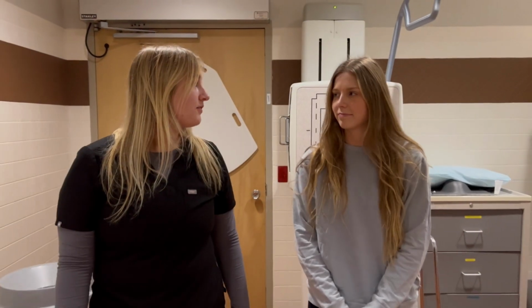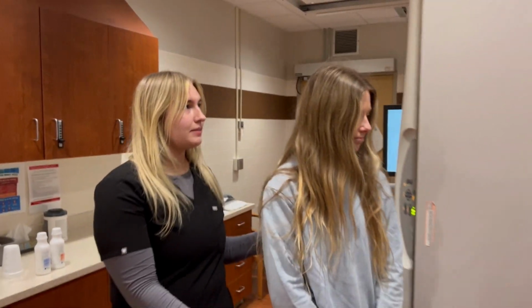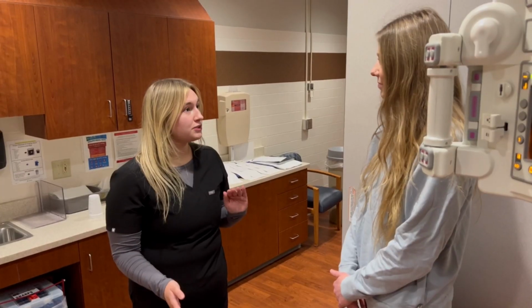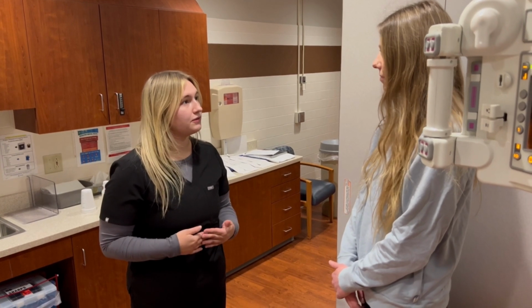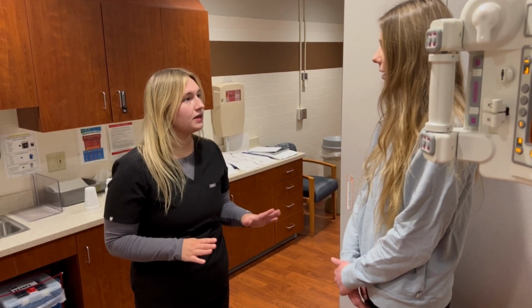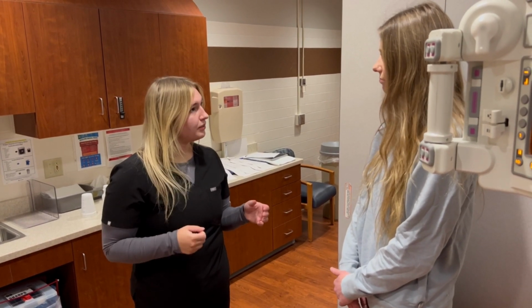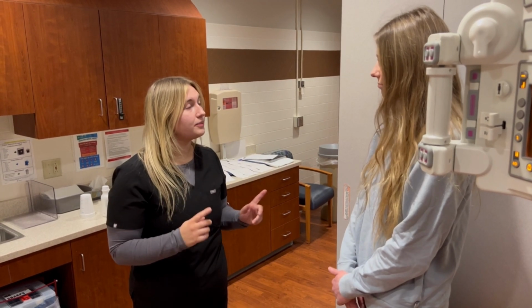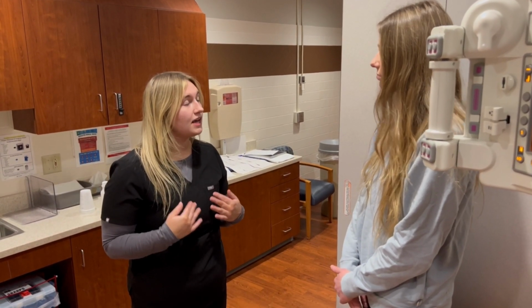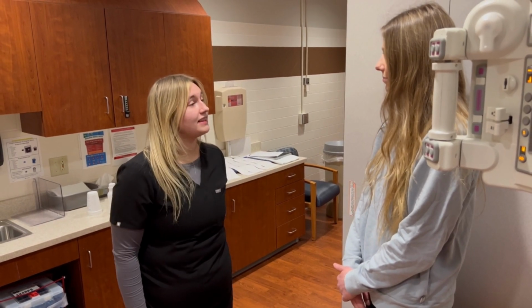Have you ever had an esophagram before, Miss Jackson? I have not. Alright, I'll have you stand up on our table. So first, we're going to give you some crystals and water to take. Try not to burp. It's going to make you feel like you have to, but try to keep it down. We're going to give you some barium. The radiologist will tell you when to drink it. We'll take a couple of pictures. Then we're going to set the table down, have you roll around a little bit to cover your esophagus, drink some more barium, take a couple more pictures, and that should be the end of the exam.